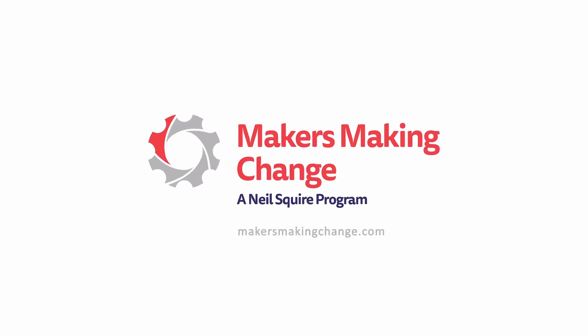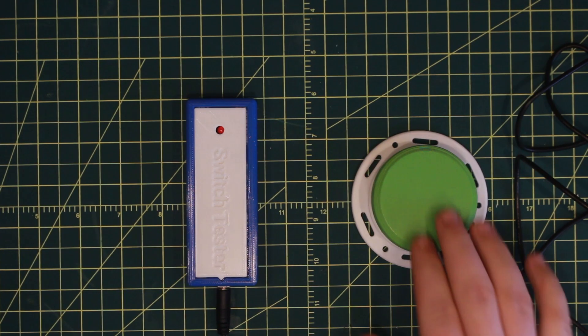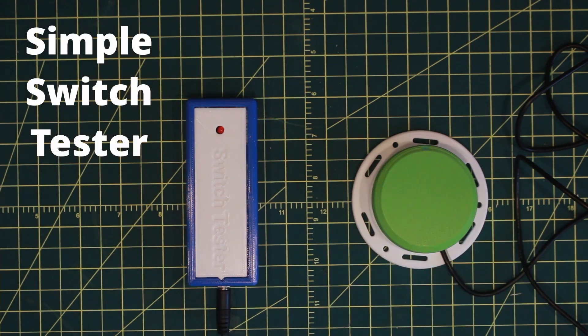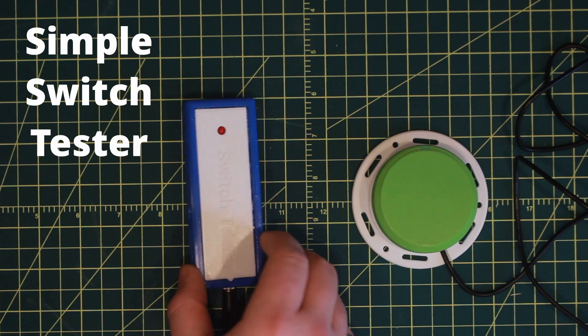Hi and welcome to a Makers Making Change tutorial. In this video, we'll show you how to build a device from our open source library called the Simple Switch Tester.